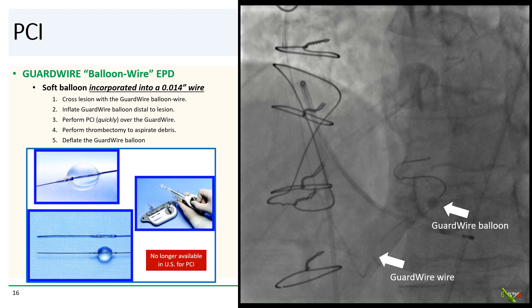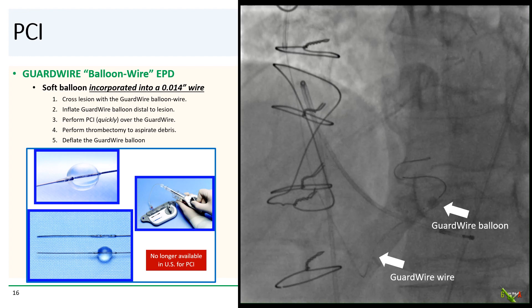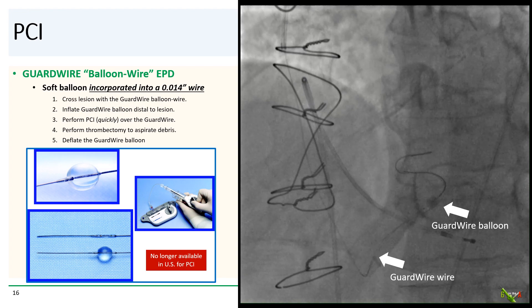So we decided to reach for the guard wire — a useful little device. It is a 0.014-inch wire with a large soft balloon incorporated within the wire itself. You cross the lesion with the guard wire and inflate its balloon at the end of the vein graft to occlude it, blocking any thrombus and debris from going into the distal vessel. You then balloon and stent the lesion quickly over the guard wire, and afterwards pass a thrombectomy catheter to aspirate all the debris and deflate the guard wire balloon.